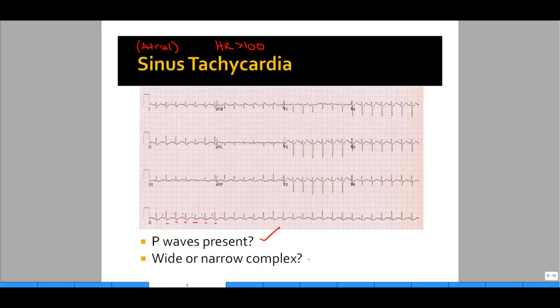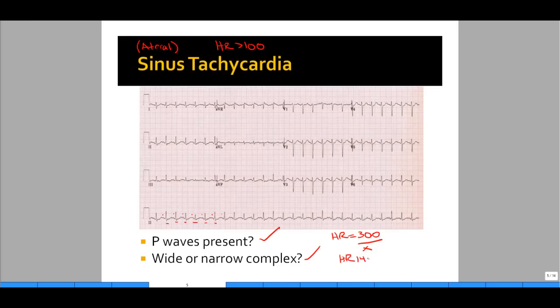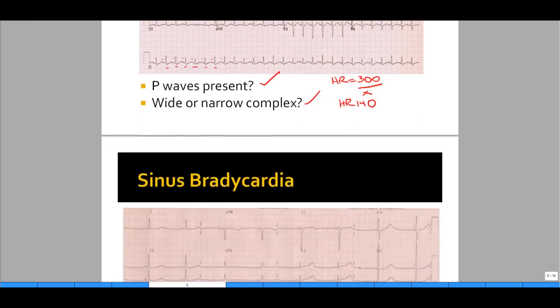Now that we have noted this is sinus rhythm, we need to look at whether this is tachycardia, normal heart rate, or bradycardia. Use the simple formula: heart rate equals 300 divided by the number of large boxes. That's about a little less than two boxes between each R, so I would probably call this a heart rate of 140 to 145. This is sinus tachycardia.